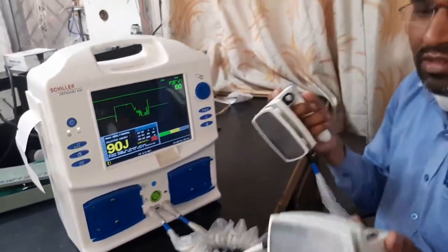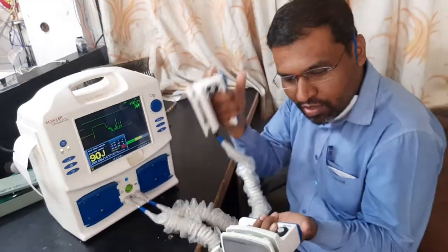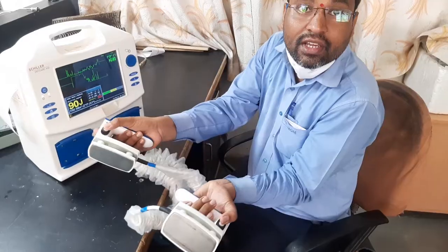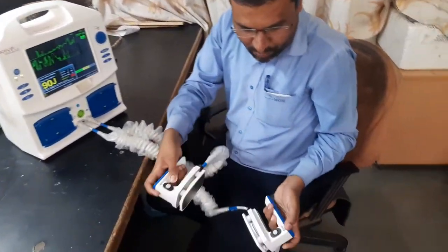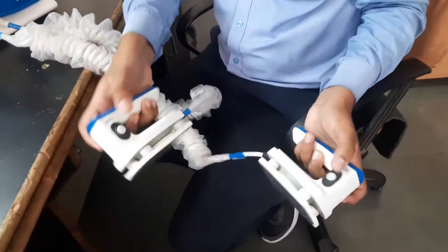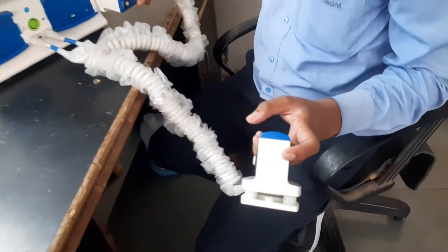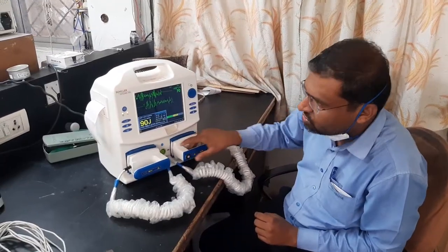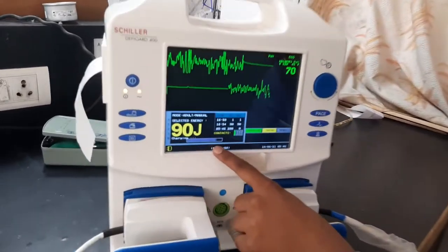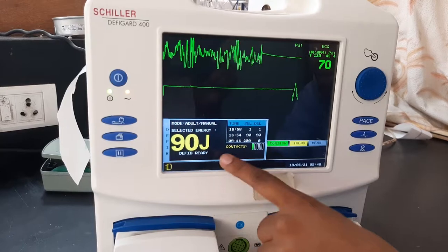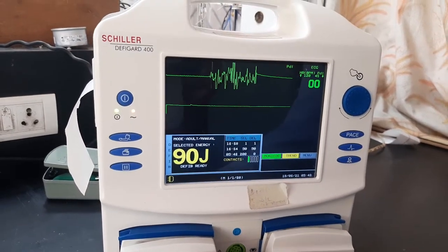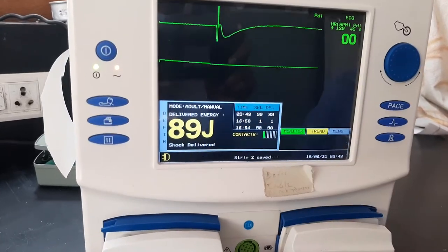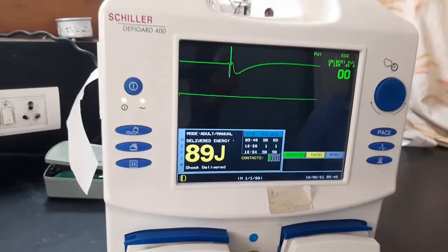Next is the shock delivery panel. You can observe these two knobs here — these are for shock delivery. You have to press both knobs simultaneously. This button is for charging. When I press the charge switch, charging is in progress. Once charged, the defibrillator is ready, and then I press both discharge buttons simultaneously. Shock delivered — I selected 90 joules and it delivered 89 joules, meaning the machine is working properly.